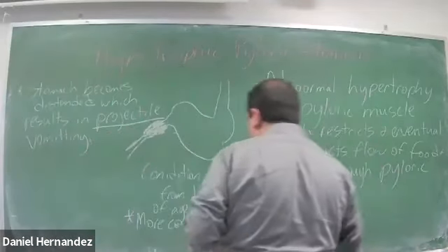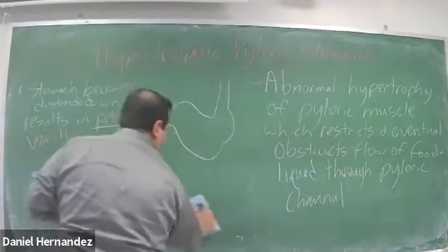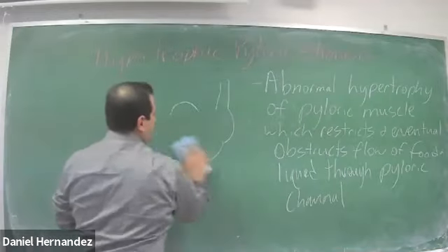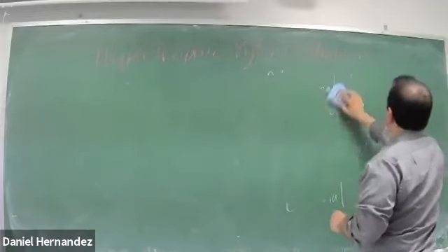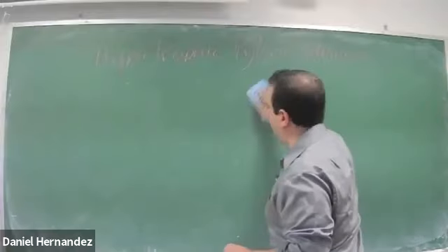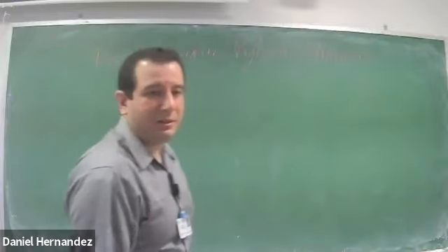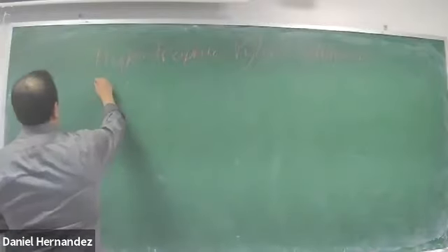So, patient prep for this exam. This exam could be a little bit challenging. It's up there with one of the more difficult ones that we do. We're going to have the baby be NPO for 2 hours, so we want to give that stomach a chance to empty if it is indeed a normal study. If this baby does not have pyloric stenosis, we have the baby be NPO for 2 hours.